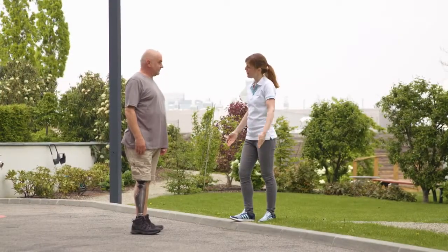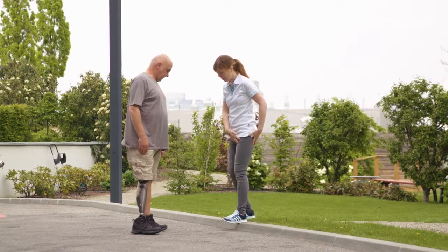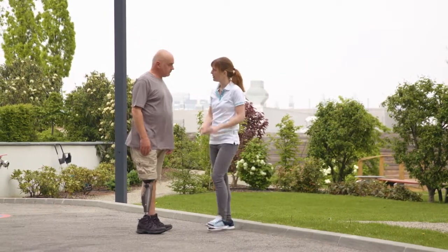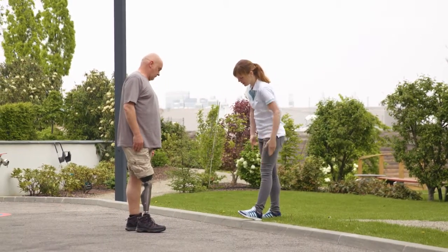Franziska once again shows Gerhard how to walk across curbs. The first option is to bend the knee and use the yielding technique. The second option is to extend the knee and use the normal stance release.